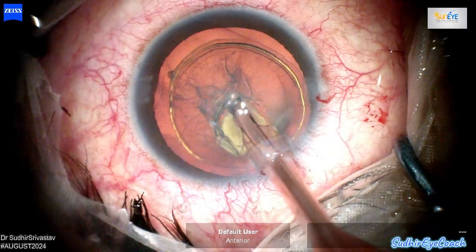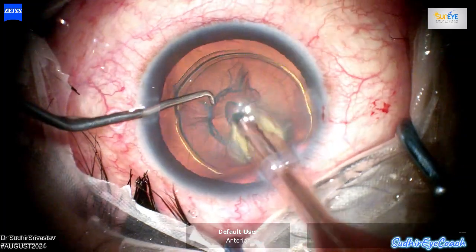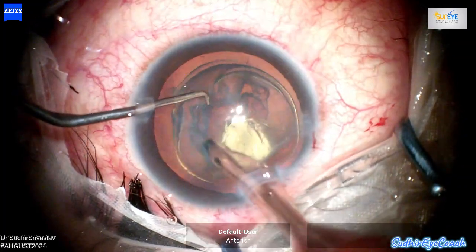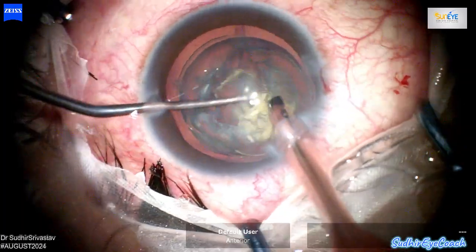In this case, because the cataract was very soft, I performed hydro-delineation 2 or 3 times to achieve effective separation. The nucleus is now well-defined with a thin rim of cortex surrounding it, which allows for safer manipulation during the next steps of the surgery.